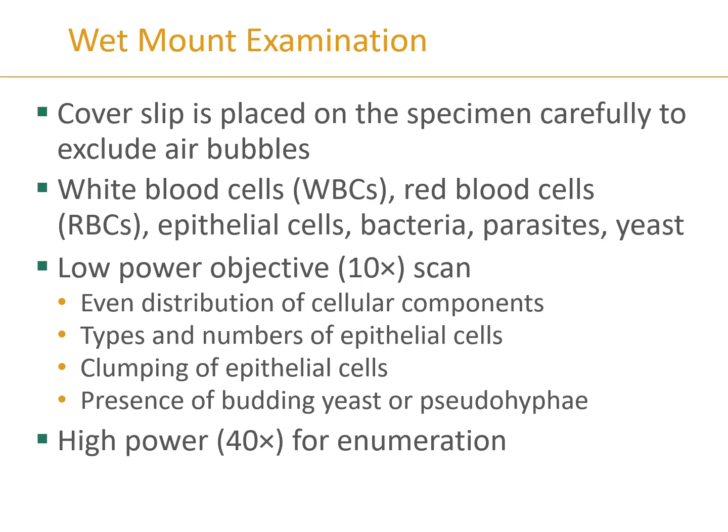You're looking at the different types of cells, the number of cells, looking to see if there's any sort of clumping, anything that stands out. And of course, you're looking for the presence of budding yeast or yeast with pseudohyphae, and sometimes those can take up large areas. So looking at it on 10x, you can get an overall picture.